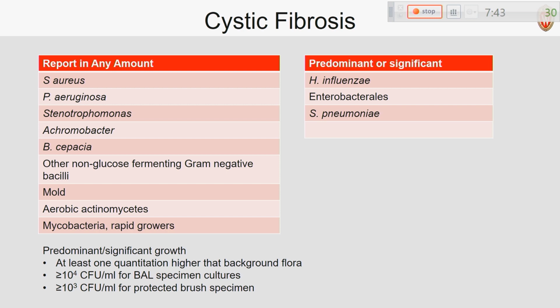So we add extra media like the mannitol salt agar, cepacia, to recover any pseudo. So basically, any Staph aureus, whether it's rare or not, we work it up. Yeah, basically everything you have listed is what we have as our guidelines. So non-lactose fermenters, depending on the quantity, we'll work it up or we may not work it up. So we actually have clinics for cystic fibrosis, so we get a lot of them in roughly once a month. So everything you have listed is exactly what we go for.